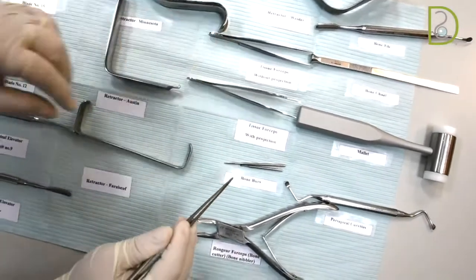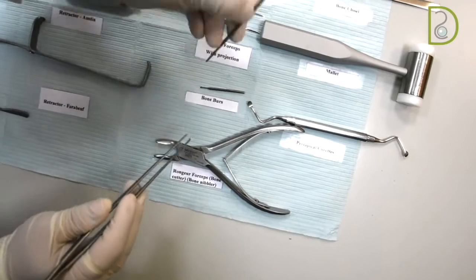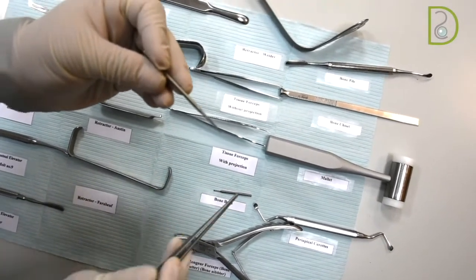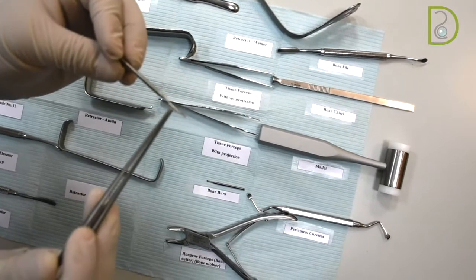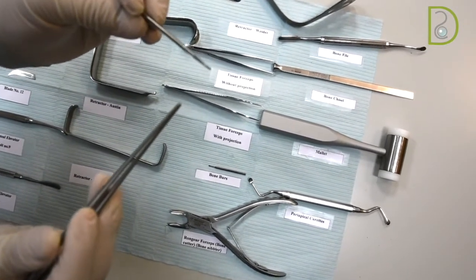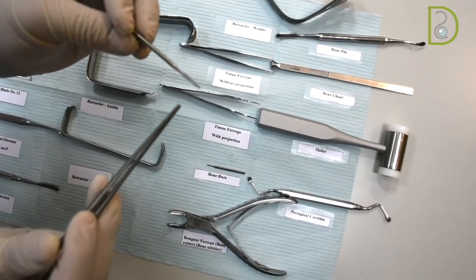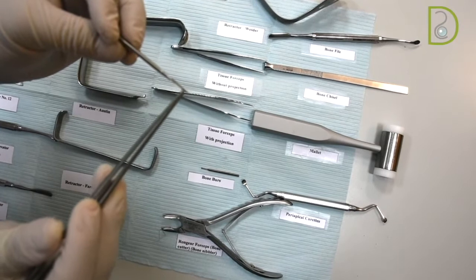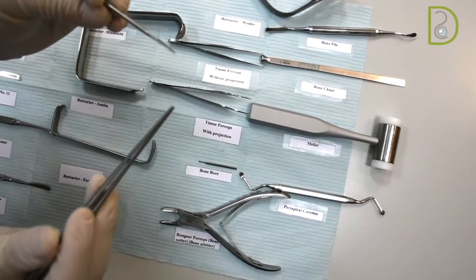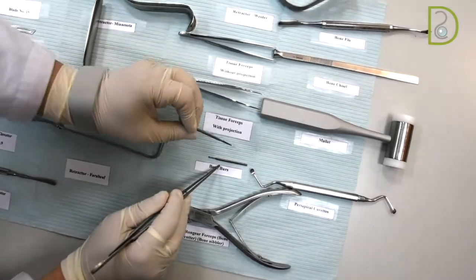Now we will come to the bone cutters, starting with the bone burs. They are in different shapes and sizes, and these bone burs, either fissure burs or round burs, will achieve multiple purposes when you cut the bone. Either you will want just to make some simple guttering, or you want to separate the two roots or three roots away from each other, your tool of choice is the bone burs.